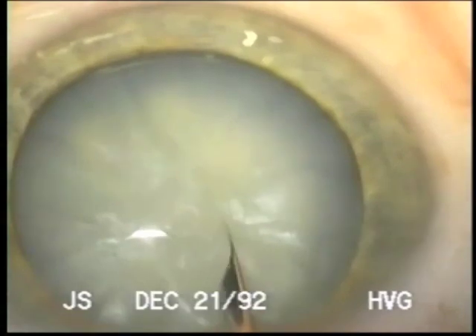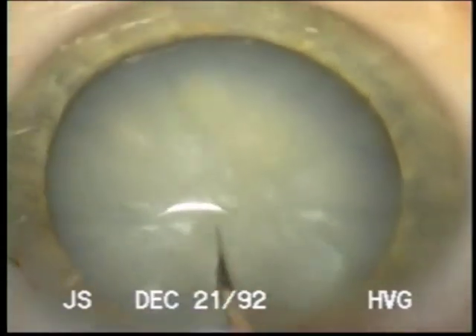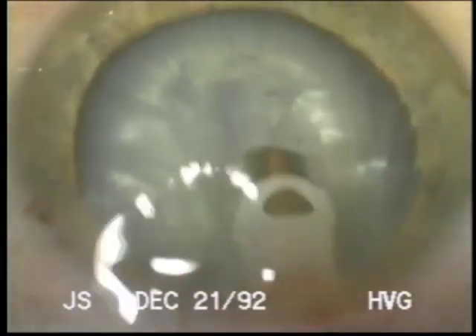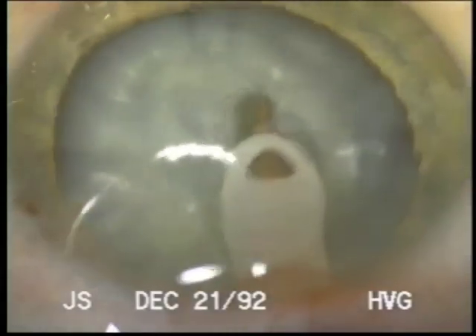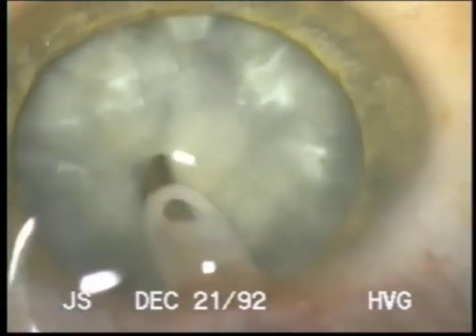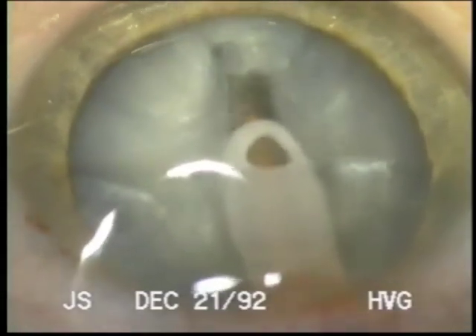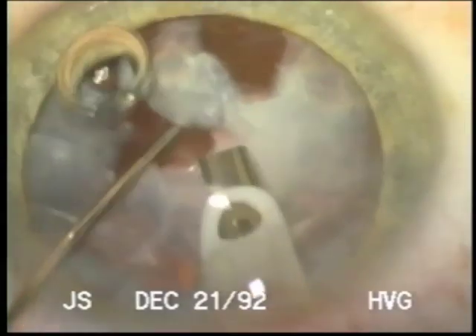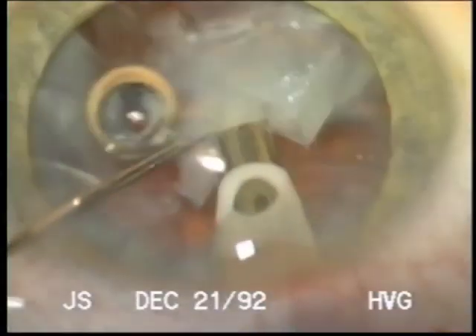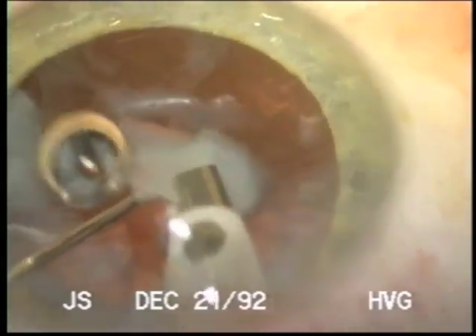This really illustrates a can opener capsulotomy that started small and then trying to enlarge it. So we're holding our breath now as we remove the nucleus that this won't extend. Any one of these little tears won't extend, and I would hesitate to use any kind of splitting technique when we don't have an intact CCC.